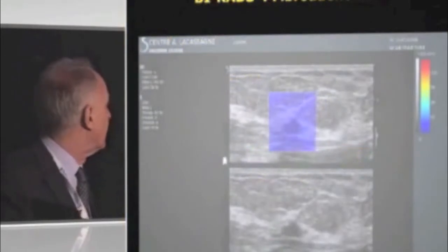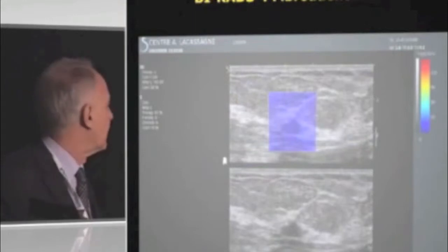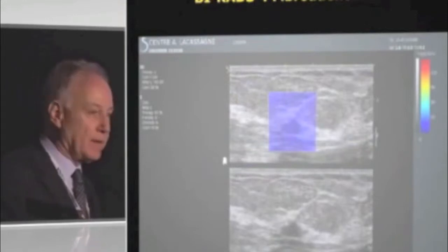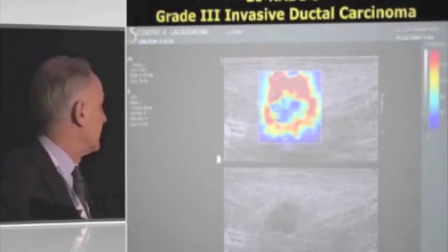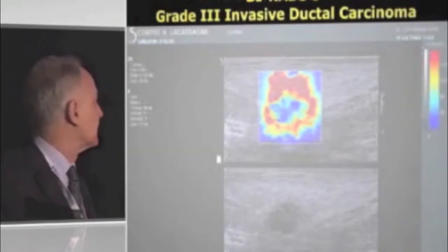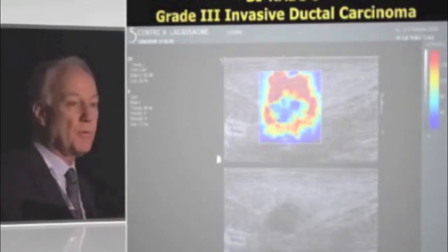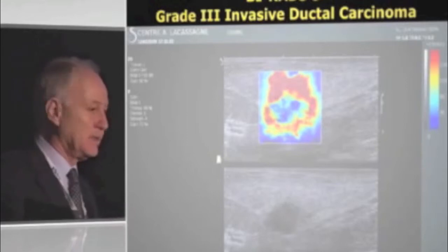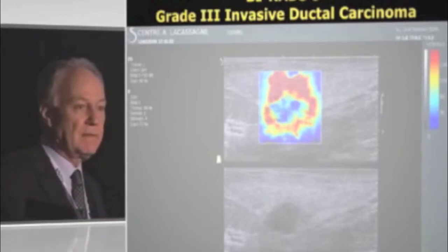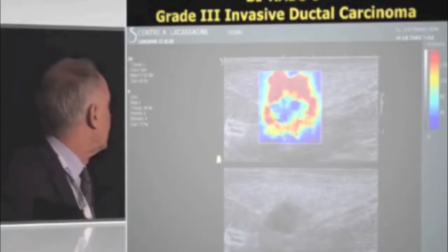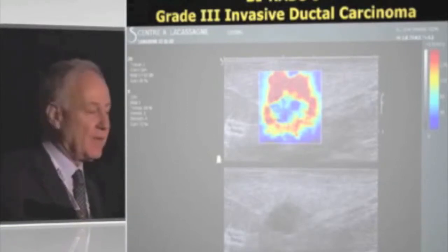Here is the color scale. A benign lesion shows low values in the blue color area. A very typical result from an invasive carcinoma often shows a ring of stiffness—a horseshoe pattern—around the stiff margins of the lesion, much larger than the lesion on B-mode. The color scale has a fixed upper limit.